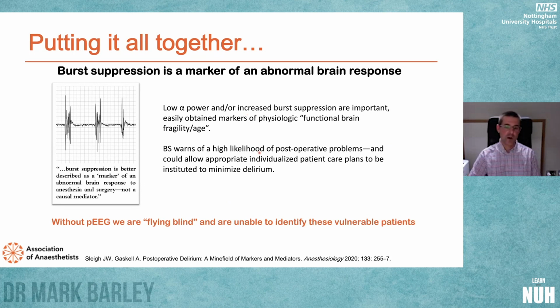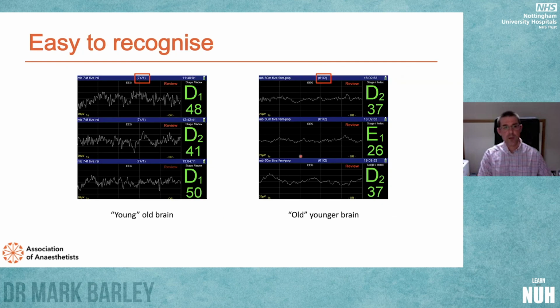Burst suppression warns of a high likelihood of postoperative problems and could allow us to individualise our patient care plans to minimise delirium. Without processed EEG, we're flying blind, and I'm unable to identify these vulnerable patients. I think it's easy to recognise.